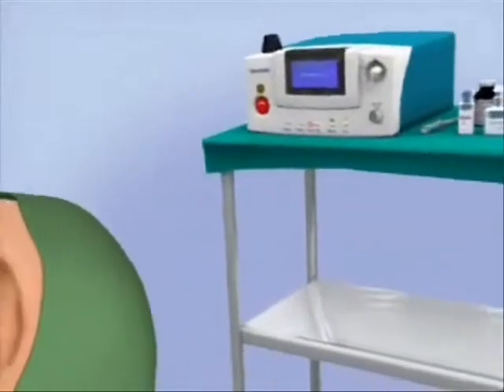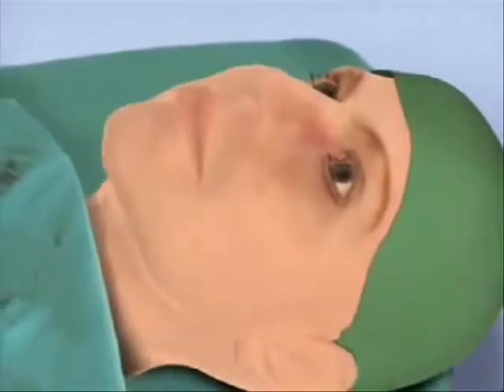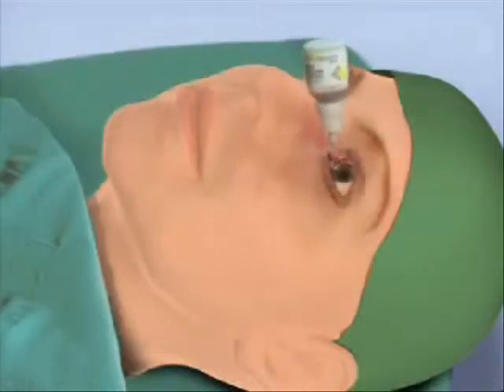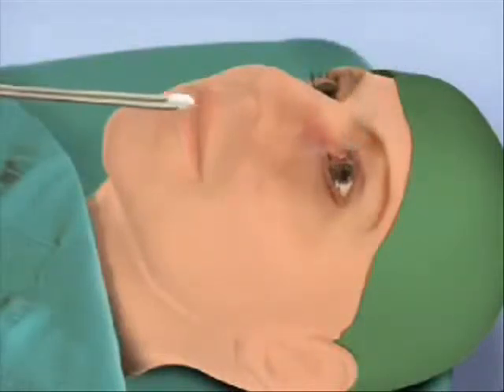Advanced techniques in laser-assisted dacryocystorhinostomy. We are now seeing considerable advances in surgery using minimally invasive techniques that reduce surgical trauma and allow fast, smooth patient recovery. Because of the reduction in operating time afforded by the laser, dacryocystorhinostomy can be performed with topical anesthetics applied to the eye surface, excretory lacrimal duct, and nasal cavity. Local regional injections are not needed, and this contributes greatly to alleviating the patient's anxiety and reducing intraoperative risk and postoperative sequelae.